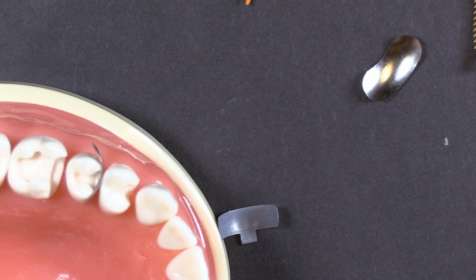Those can be tricky. Also, how to grip on a canine or bicuspid, and what to do if the curve of Spee is such that the hoop of the ring doesn't want to go down all the way because the curvature of the teeth at the front of the mouth is preventing the hoop of the ring from sitting down in a natural position.